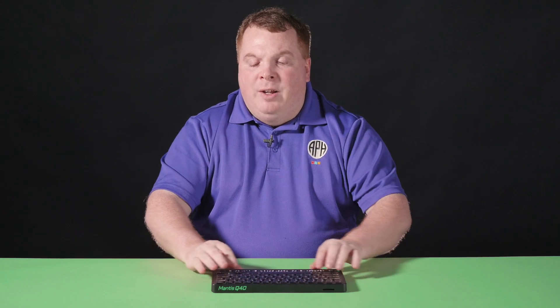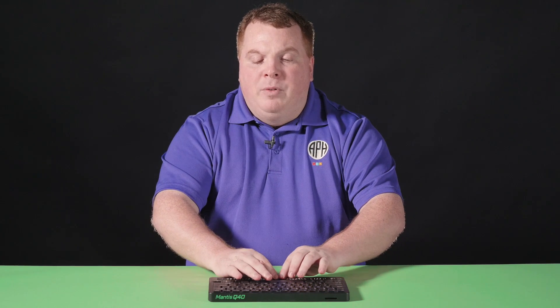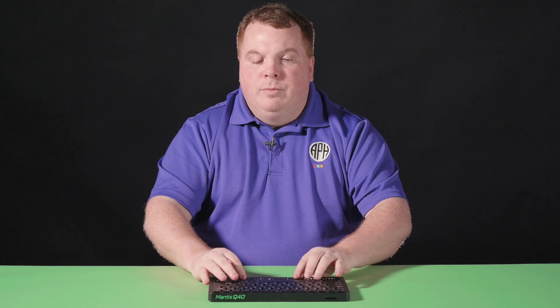The Mantis is compatible with the following screen readers. With Windows, it's compatible with JAWS and NVDA. With Apple devices, it's compatible with VoiceOver. And on Chrome OS, it is compatible with ChromeVox using USB-C only.